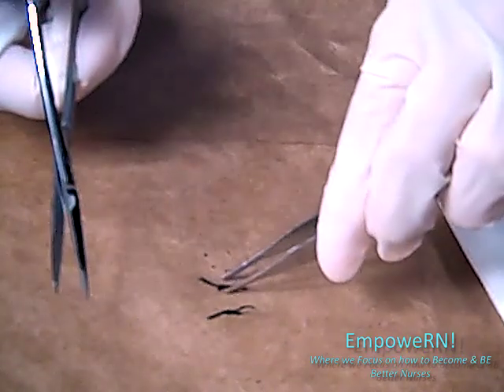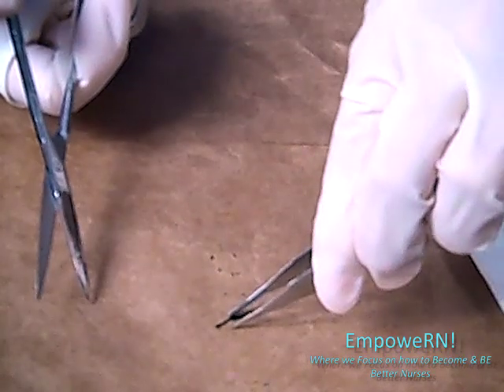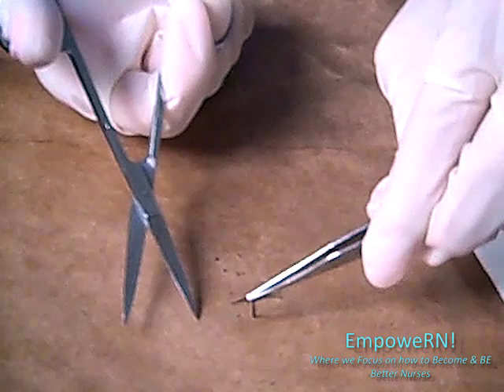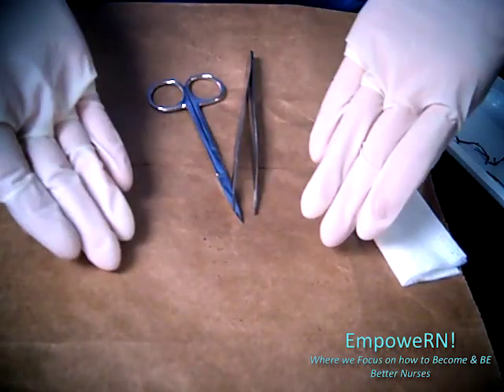Now we go to get the third one and we cut here. And finally the fourth one. It's really easy when your patient has four sutures — a little bit of a different story when they have 26 or 20. Okay, so that's it.